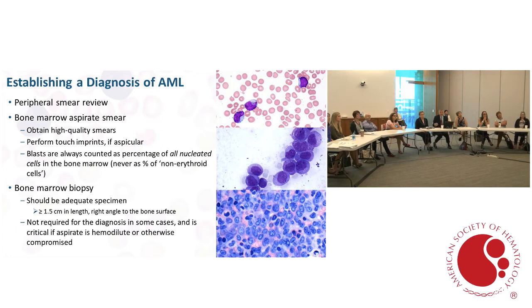They all have very high N:C ratio. Burkitt lymphoma can sometimes mimic AML. I've also seen AML blasts that can have basophilic cytoplasm and vacuoles, particularly pure erythroid leukemias, which can look like that and can look like Burkitt lymphoma cells.